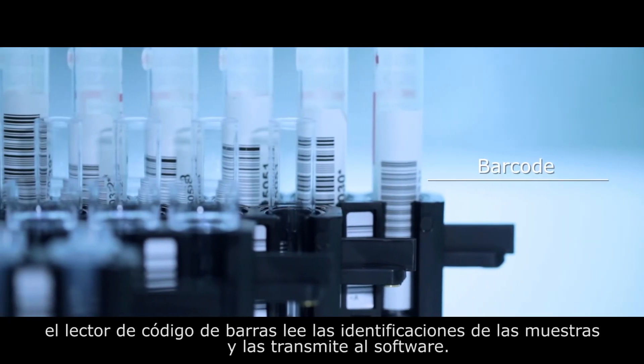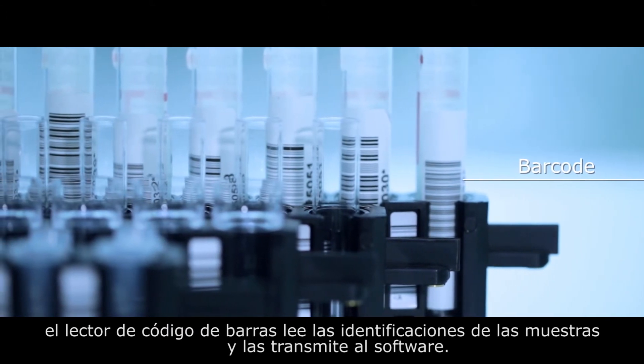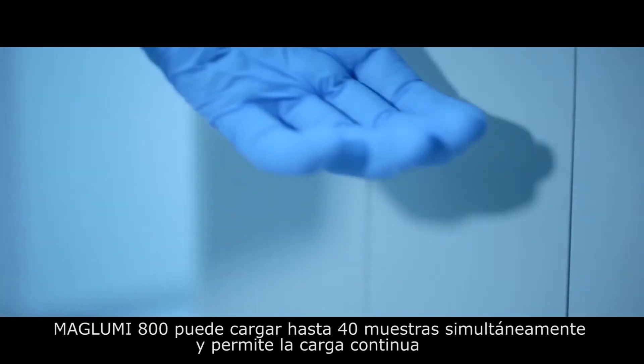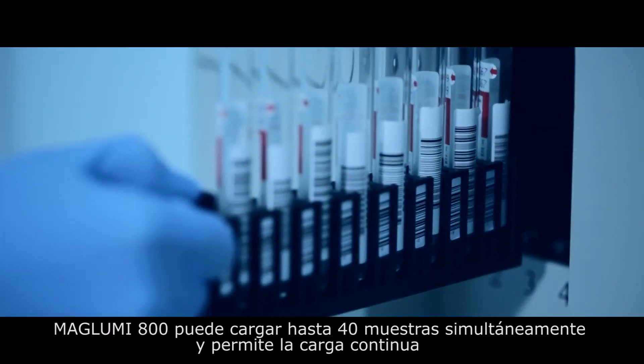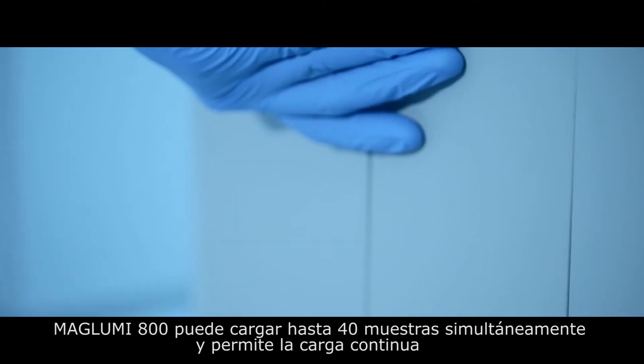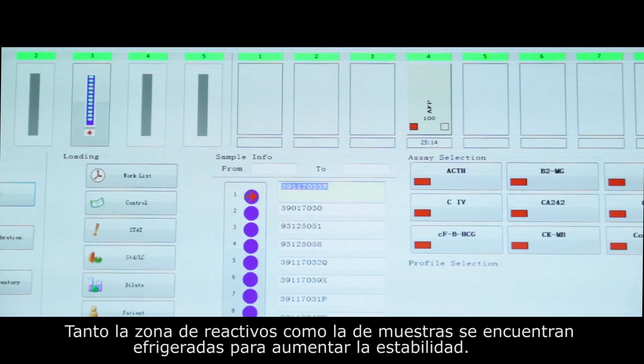Samples can be loaded with different types of sample tubes. When loading the sample, the barcode reader scans the barcode on the tube and identifies the sample ID, sending the information to the software. The Maglumi 800 sample area has a maximum capacity of 40 samples and can continuously load samples.